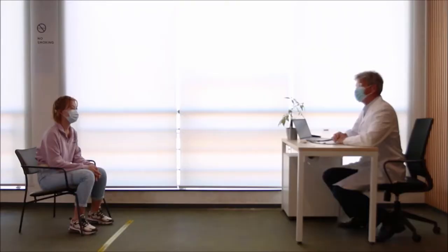Auscultation from a distance is safe and beneficial. Compliance with the PPE protocol is needed. It is time for us to advance.